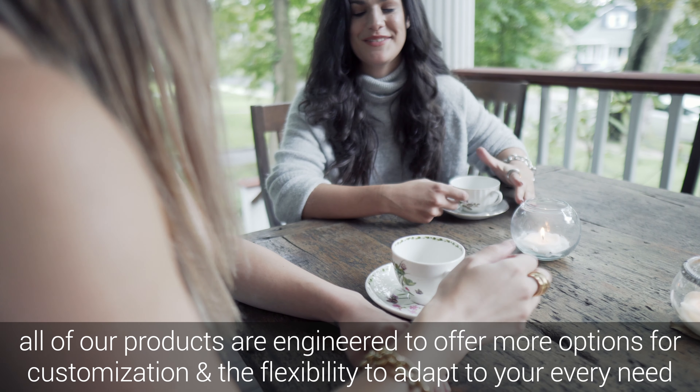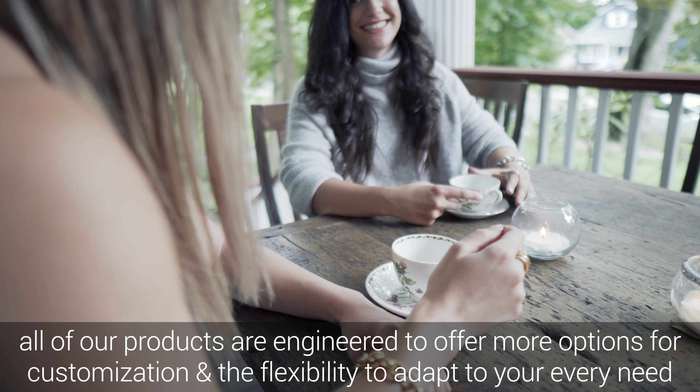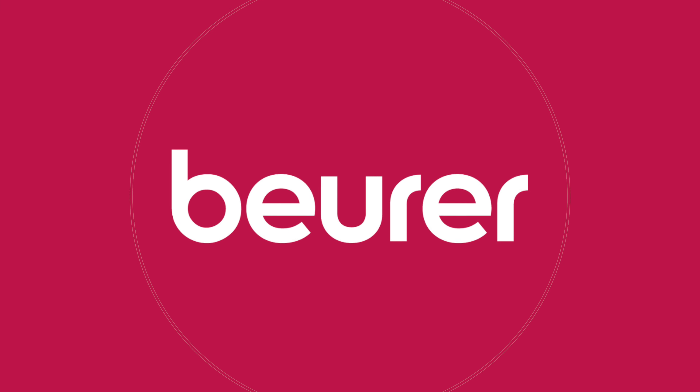All of our products are engineered to offer more options for customization and the flexibility to adapt to your every need. Where there is pain, there is Beurer.